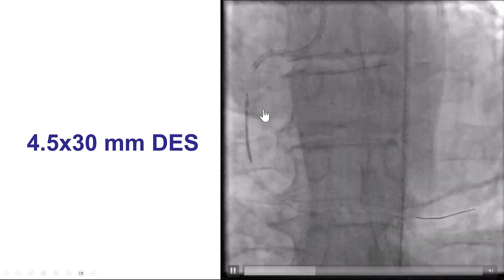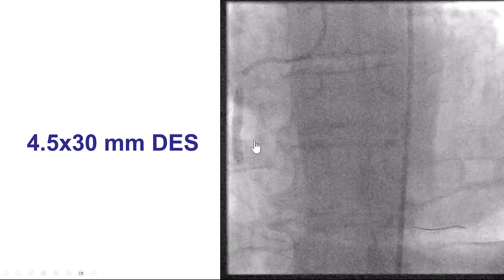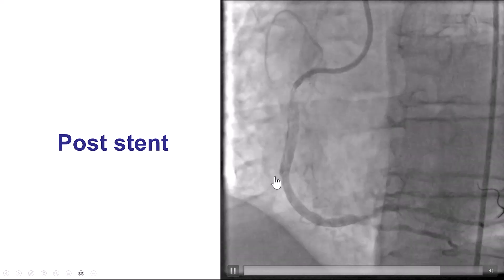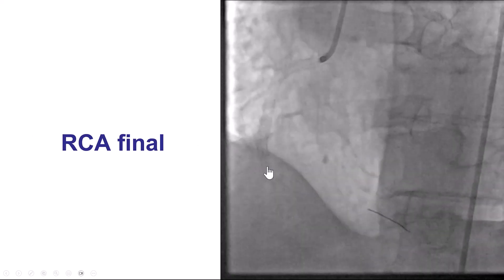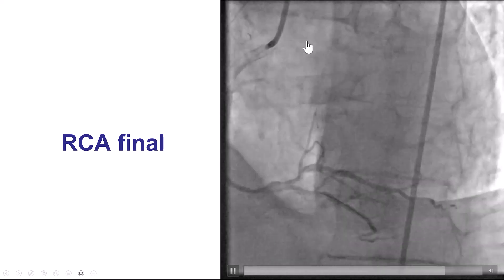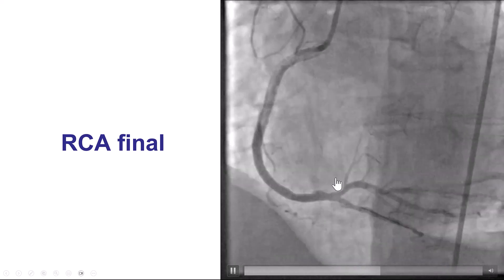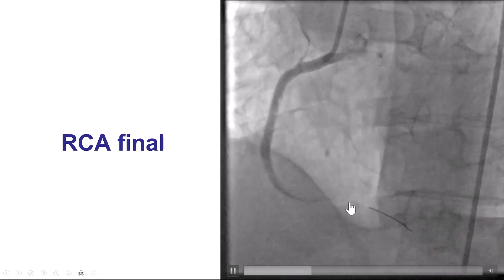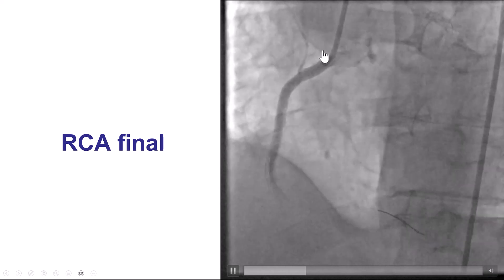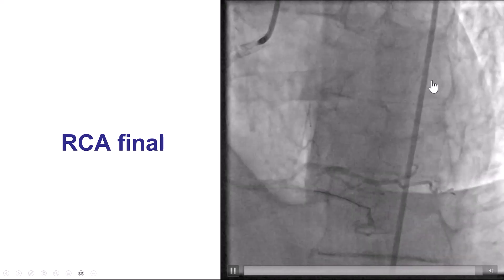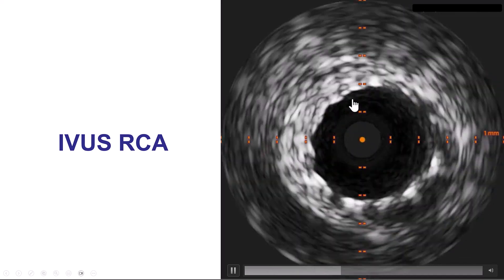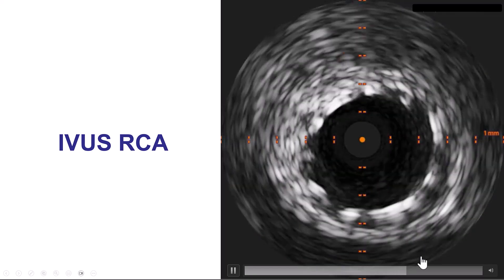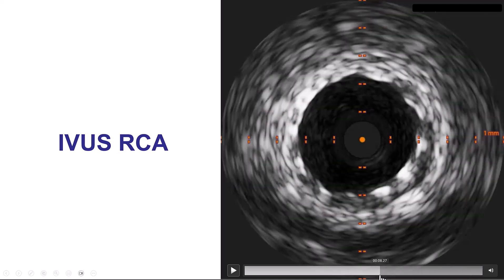We placed a 4.5-by-30-millimeter drug-eluting stent, which was deployed, but the distal edge didn't look perfect, neither did the proximal edge. So we decided to cover distally with another short stent and then proximally with another stent. This was the final result, showing good flow into the right coronary artery. There was some transient no-reflow that resolved by giving intracoronary nicardipine. We do have nice backflow into the aorta. The IVUS on the right coronary artery going all the way to the ostium confirmed a well-expanded stent extending into the aorta.